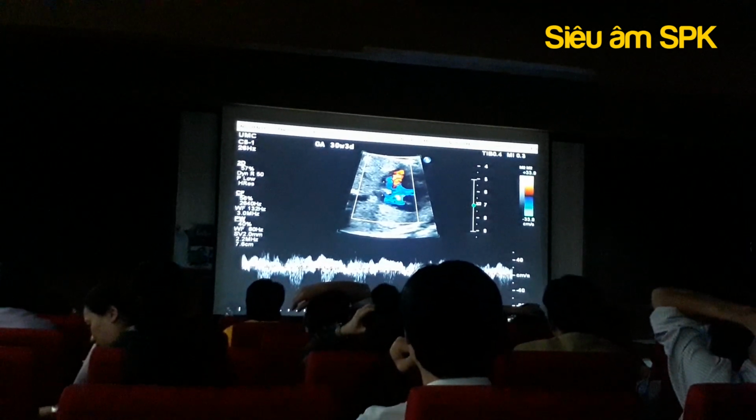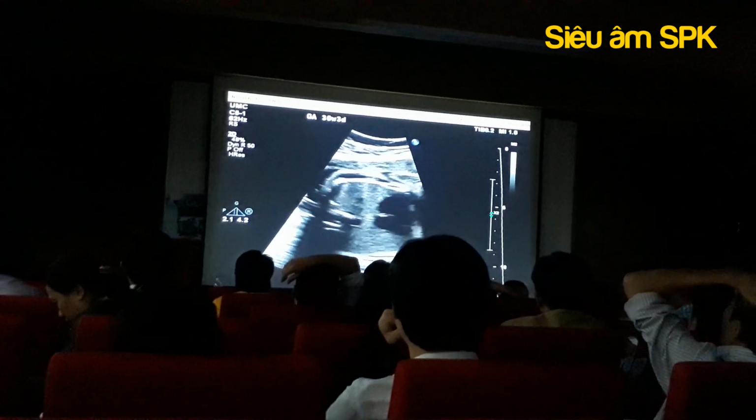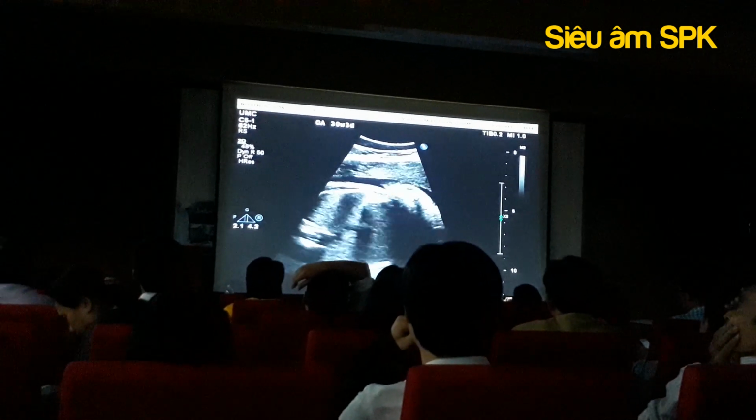So I think at this point we've seen all of the major structures except for that right pulmonary artery.